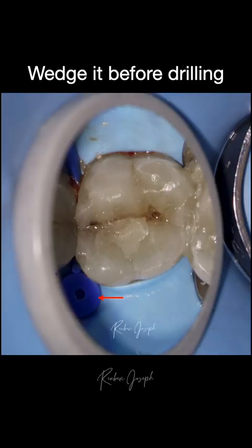Here's another variation of what we have discussed earlier. This is a tooth which has a fracture proximally. Generally these fractures run deep, and if you drill into these fractures, there's a very high possibility it is going to go well below the gingival margin and you're going to get stuck for isolation again.